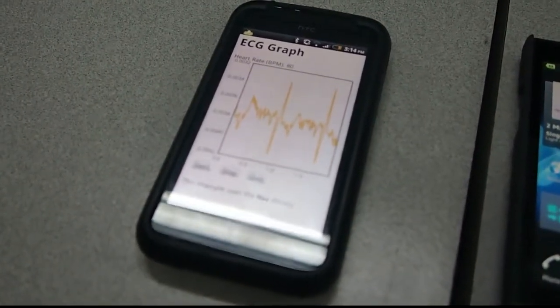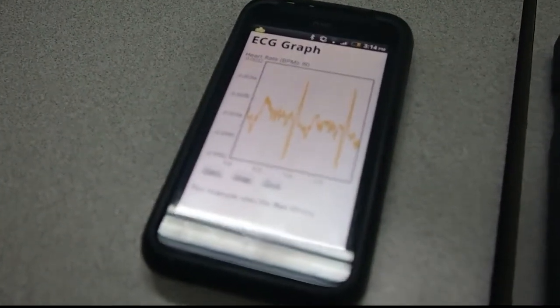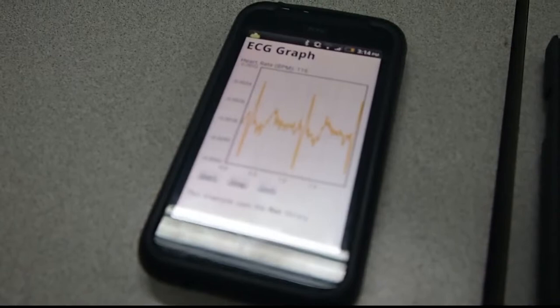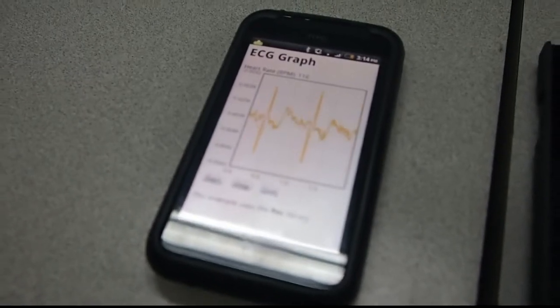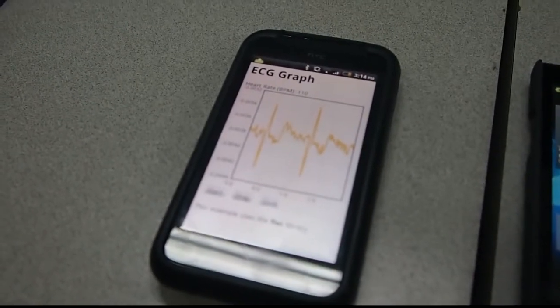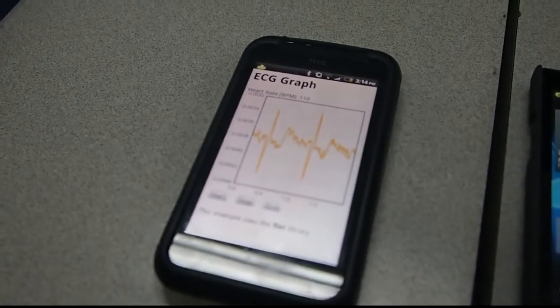As you can see, the waveform comes out and it's a healthy waveform, and the heart rate is also healthy.